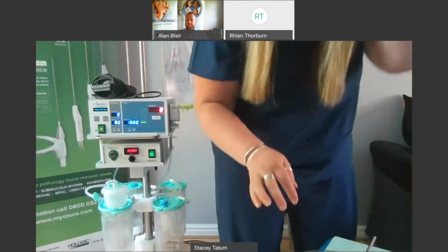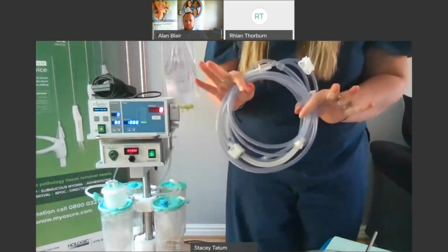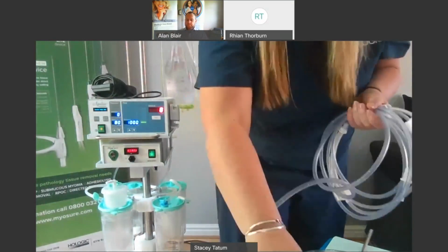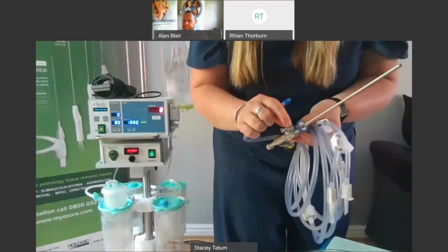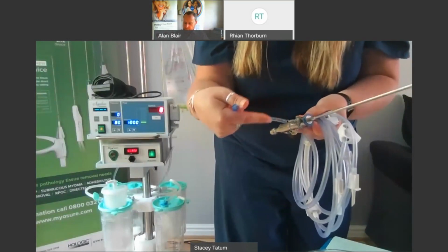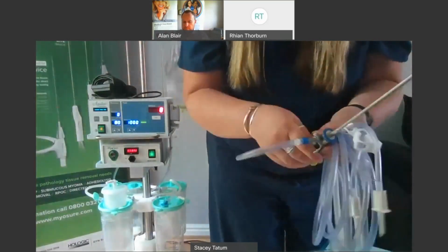So once you've put your bungs in, then you need to connect your tubing. The inflow tubing is color coded, it's blue, and that is going to go onto your inflow tap. Most of your scopes will have a blue arrow on your inflow tap, but if that blue arrow has faded, then the arrow pointing in towards your scope is your inflow. And it's a little luer lock, so it just sits on there.